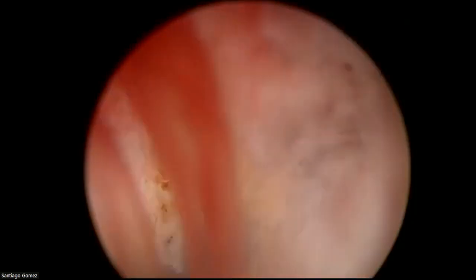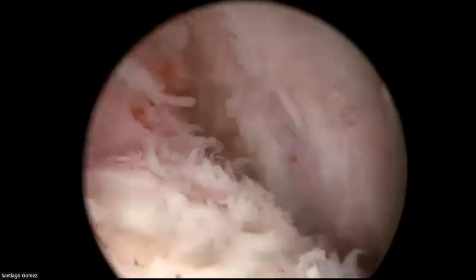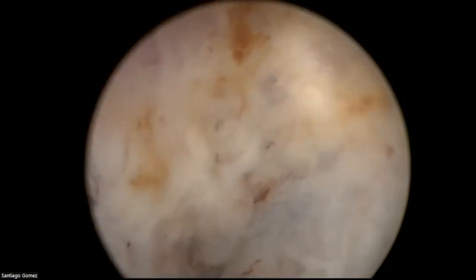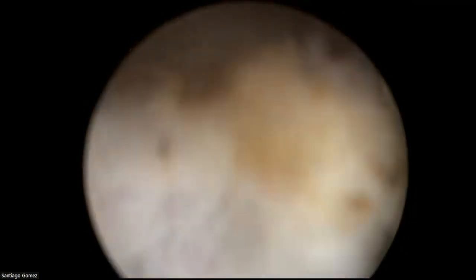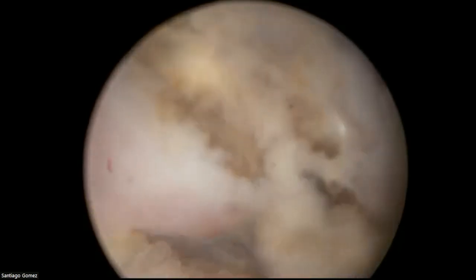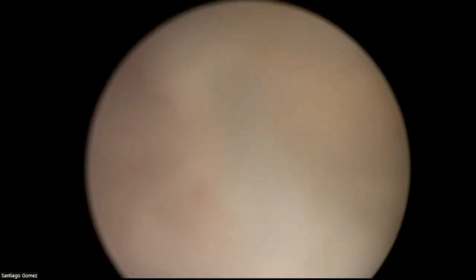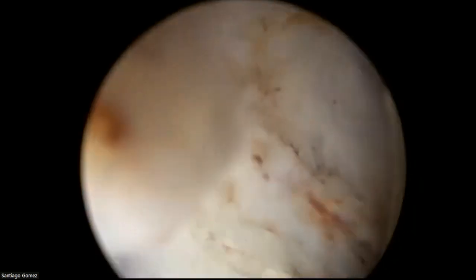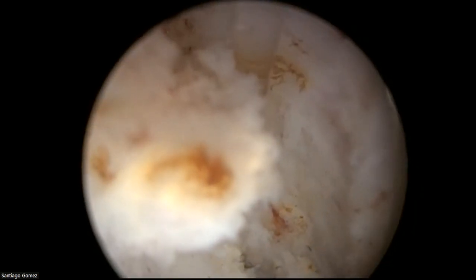So here now we are getting towards 12 o'clock. So I'll do another, let's say, closer to the 12 o'clock incision for access. And then I will try to see if I can understand this plane that we saw here. Sometimes we get so close to the tissue, I'm going to try to focus a little bit closer if I can.